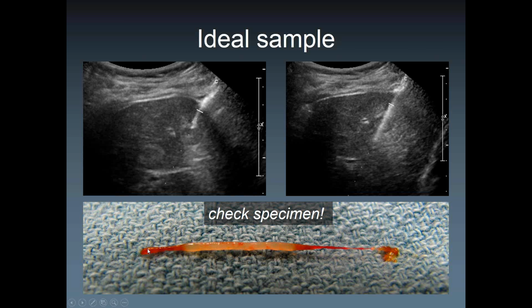So distal to the target gives some reference tissue, which is like liver in this case. So liver is usually red or brown, as you know. Target tissue is mostly white because most targets are malignant tumors. Malignant tumors, with one exception, are usually white. The exception is melanoma, but many melanomas are white as well. Just keep that in mind.